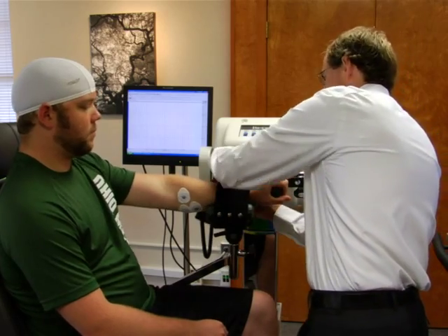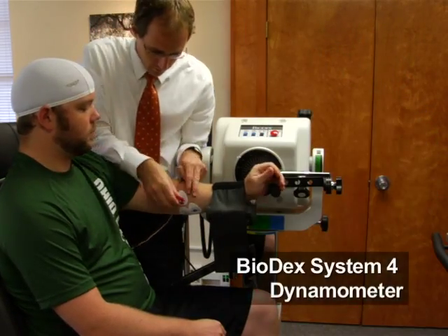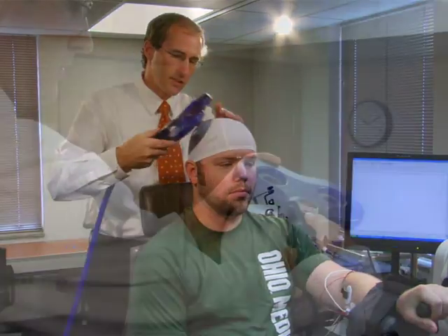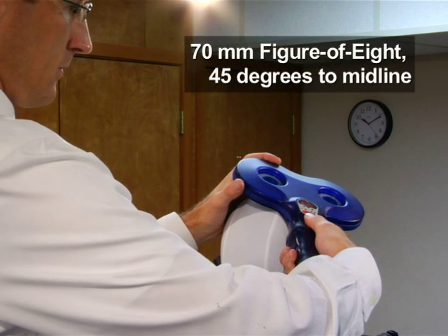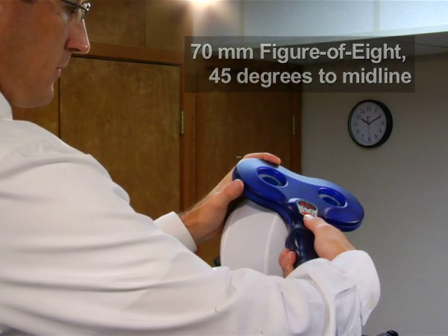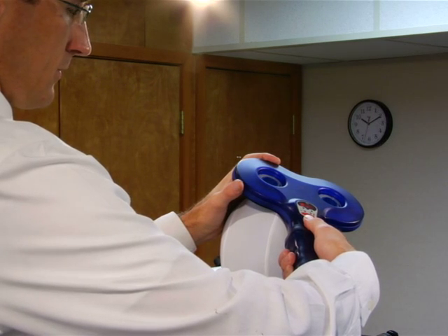Now have the subject sit with the left arm resting in an extended position in a Biodex System 4 dynamometer. In this protocol, we will stimulate the right side of the brain, which controls the left arm. To stimulate the FCR muscles, place a 70mm figure-8 TMS coil tangential to the scalp and 45 degrees to the midline so that the induced current flows in a lateral posterior to medial anterior direction.